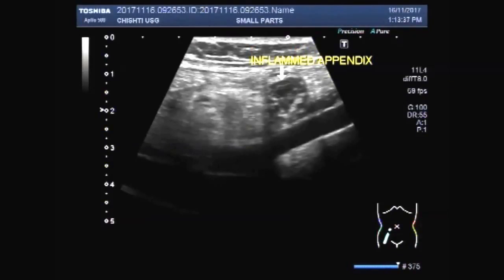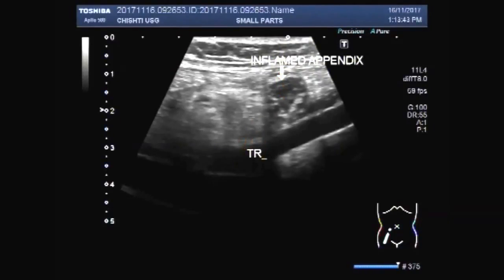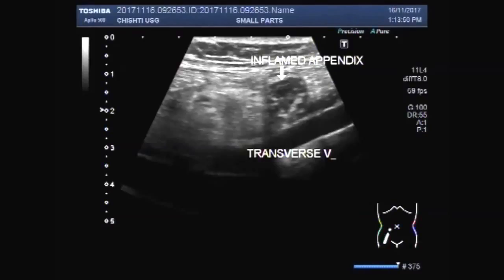You can see the transverse diameter of the inflamed appendix in the transverse view.